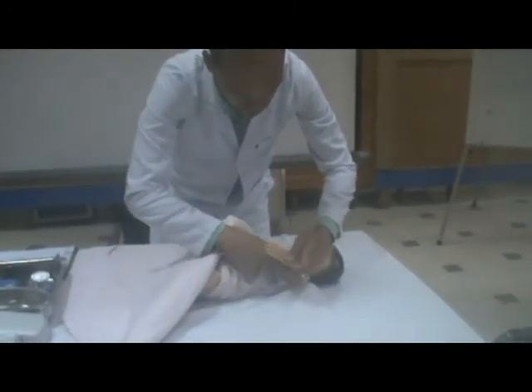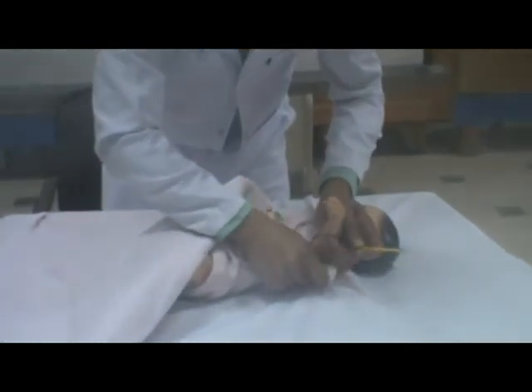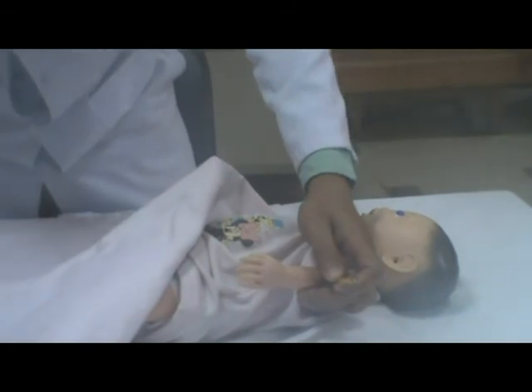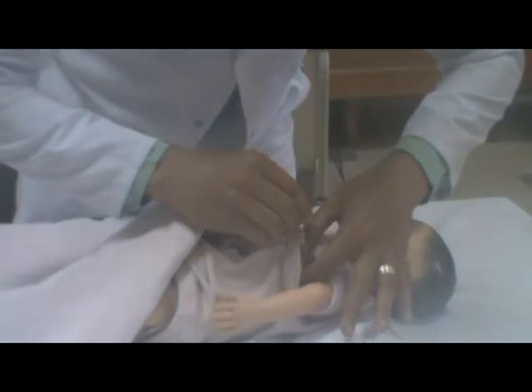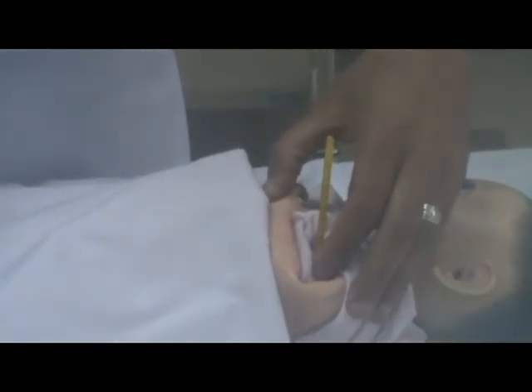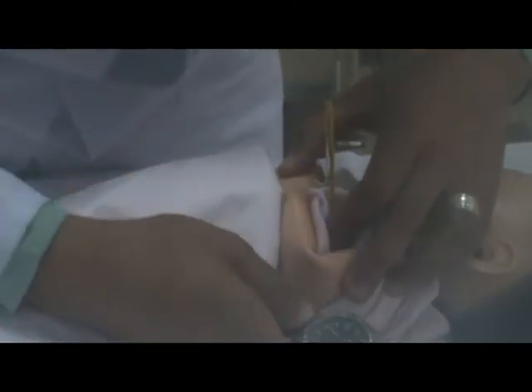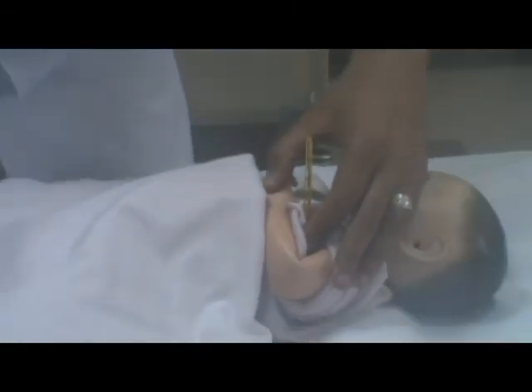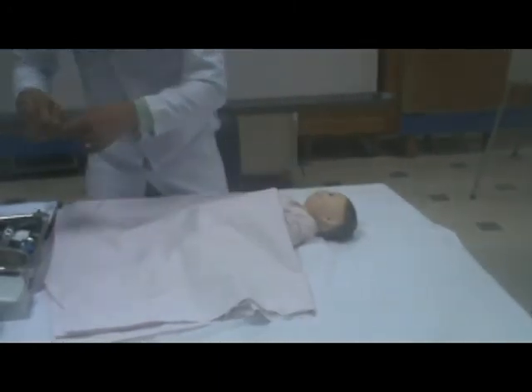Place the thermometer under the axilla and bring the arm across the chest. The thermometer must be placed between the two dry surfaces of the axilla, ensuring no clothing touches the thermometer bulb. Leave in place for 10 minutes to ensure the thermometer is in contact with skin surfaces. Remove the thermometer and wipe it with dry cotton swabs. Read and record the temperature.